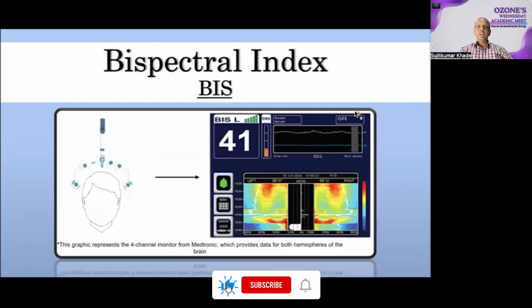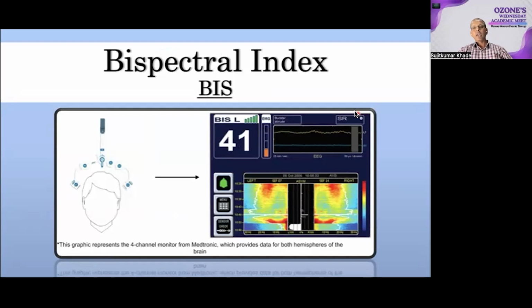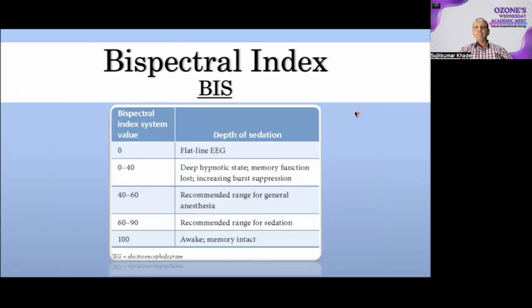BIS is a processed EEG indicator of hypnosis where 0 denotes the isoelectric state while 100 denotes the fully awake patient. The BIS uses frontal EEG electrodes and signal processing. BIS can be used regardless of anesthetic type, whether it is inhalation anesthesia or TIVA. A BIS value of 0 represents persistently suppressed EEG activity and 100 indicates a fully awake state. A target range between 40 to 60 is the proposed range in which patients have a lower risk of experiencing intraoperative awareness with recall during general anesthesia.